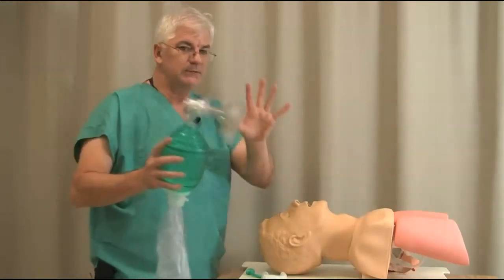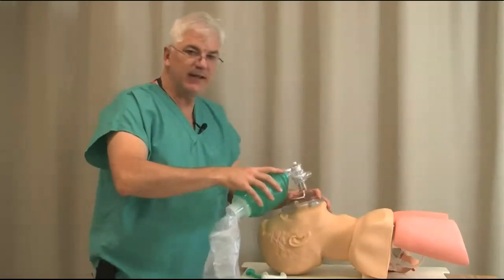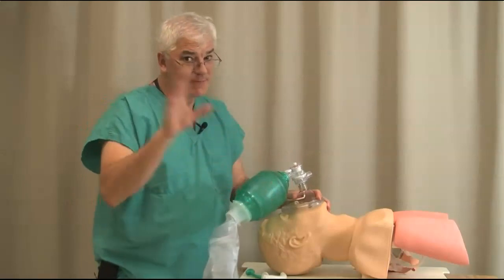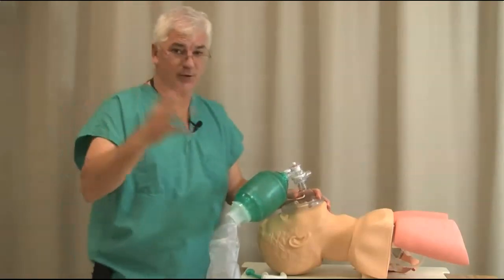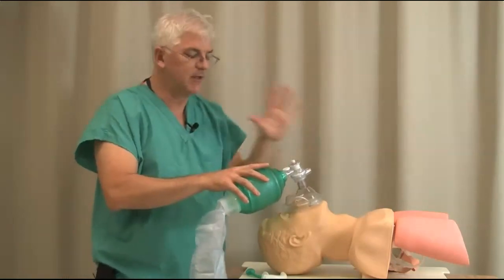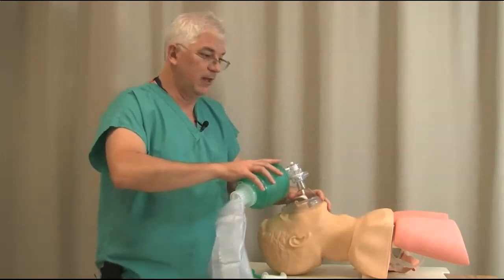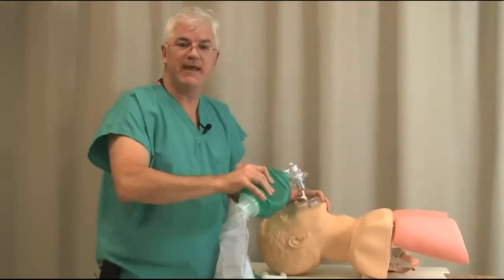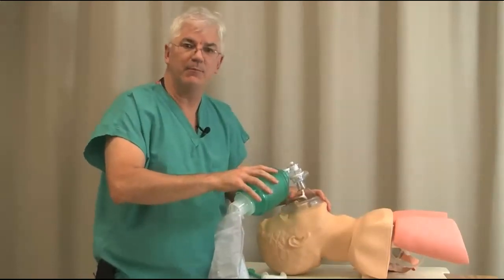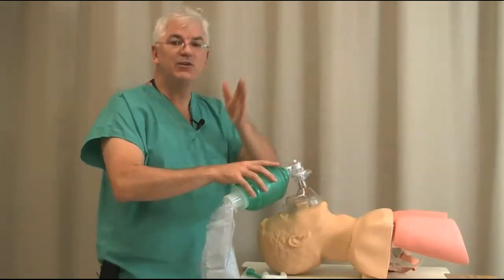Well, you've got to walk before you run, and mask ventilation will probably save more lives than intubating over the course of your career. So let's not leap into intubating. Let's focus on good mask ventilation. It's the first thing you can do. You can always mask ventilate while they're getting the equipment. That will often stabilize your patient, and it'll often make intubating easier.